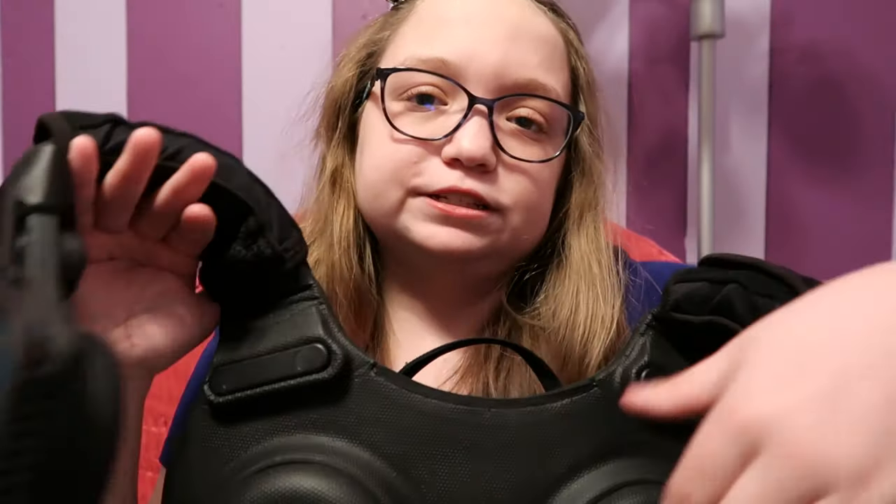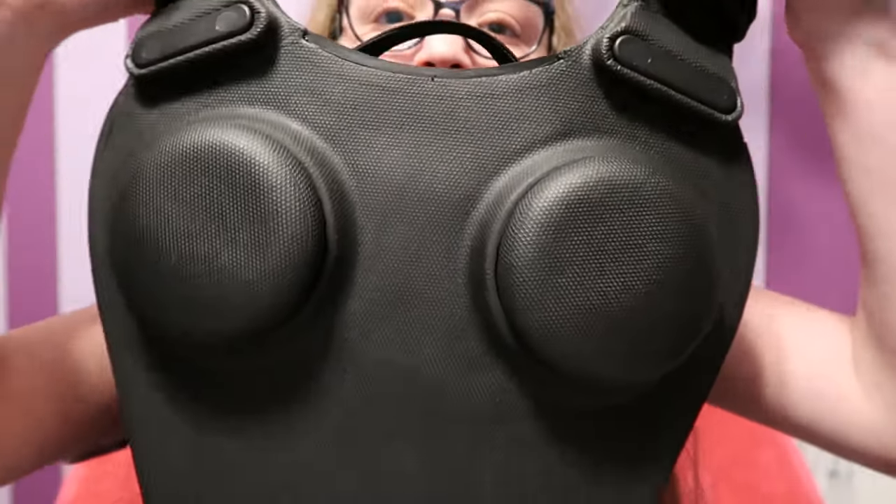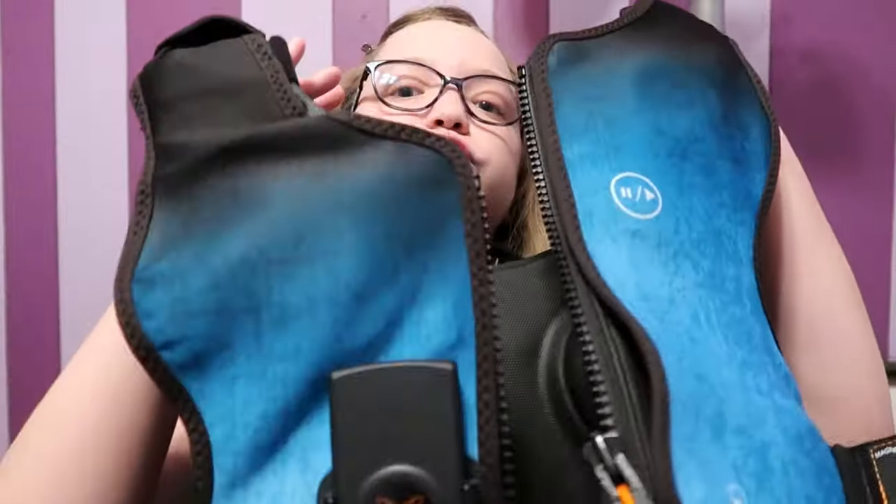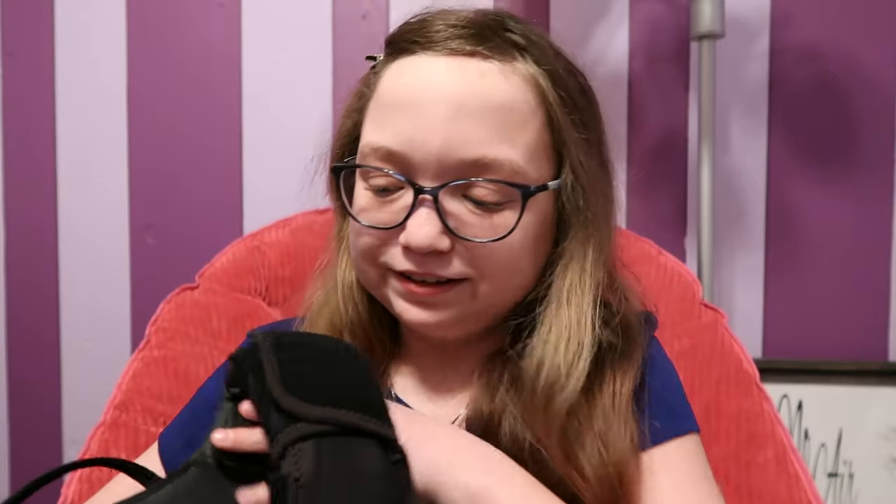There are these little pods — four on the back and then two in each of these side panels. I'm going to put it on and then show you all the details. It's kind of heavy; it's 13 pounds. But once you get it on, it's pretty doable.